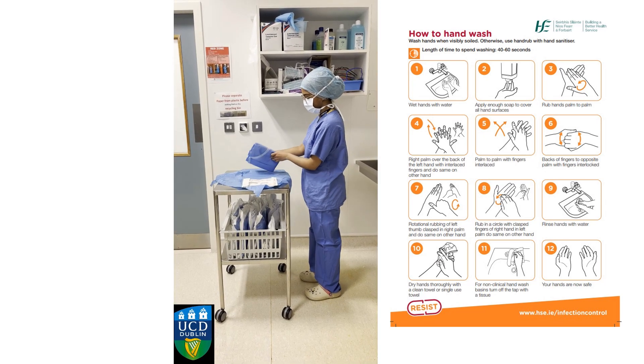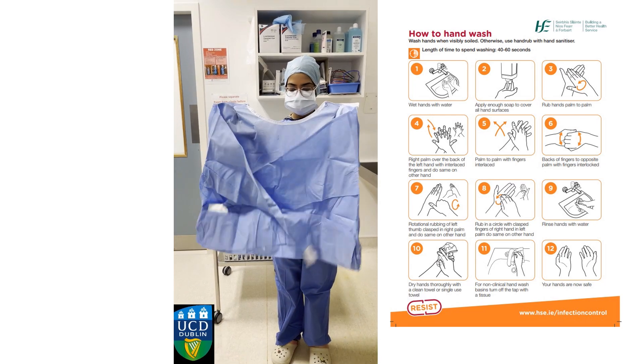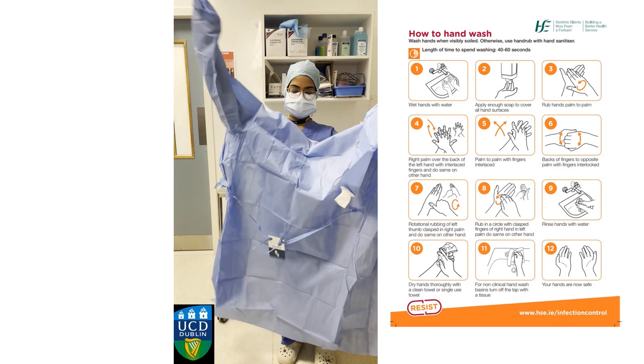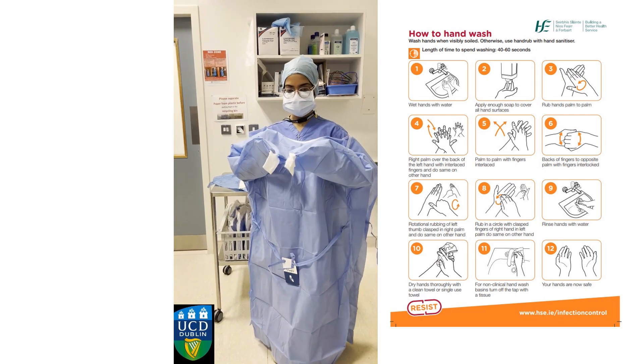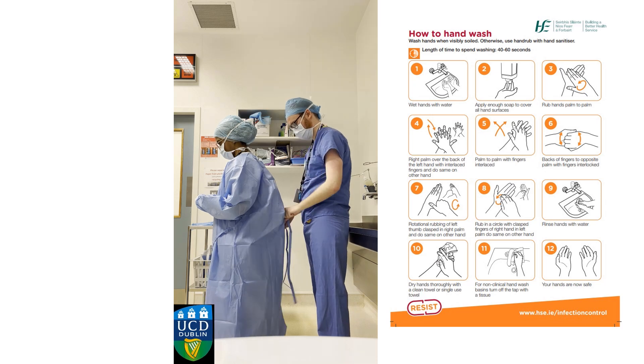Put your hands into the sleeves found on either side of the gown. Hold the gown and let go of the bottom part. Pull your hands through the sleeves, making sure your hands remain within the white ends of the sleeves. Ask your assistant to help you tie up the gown at the back.